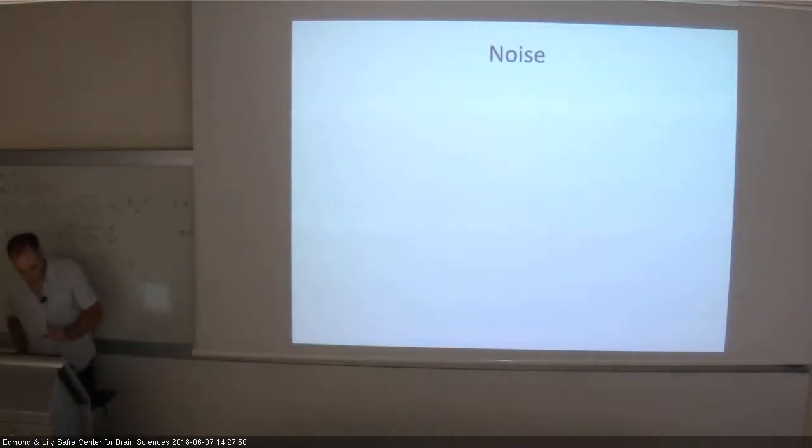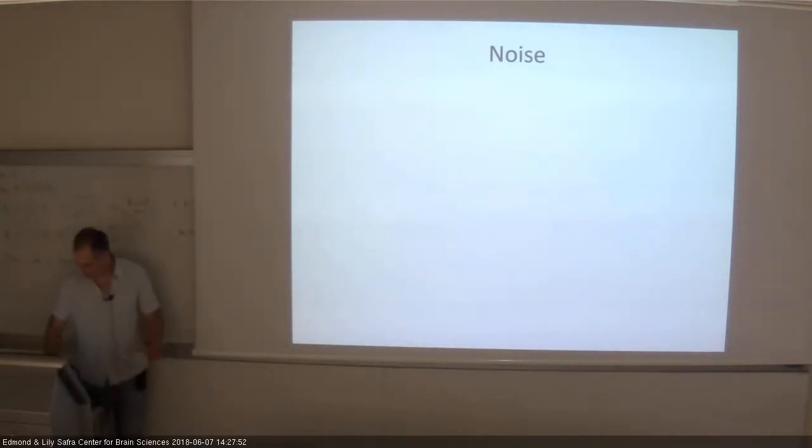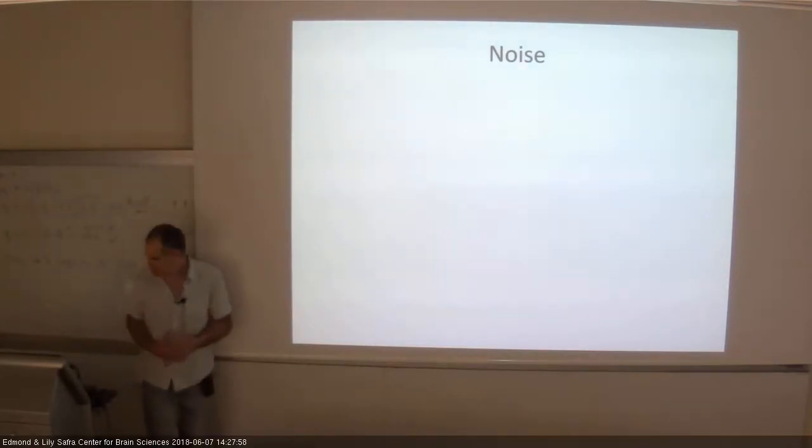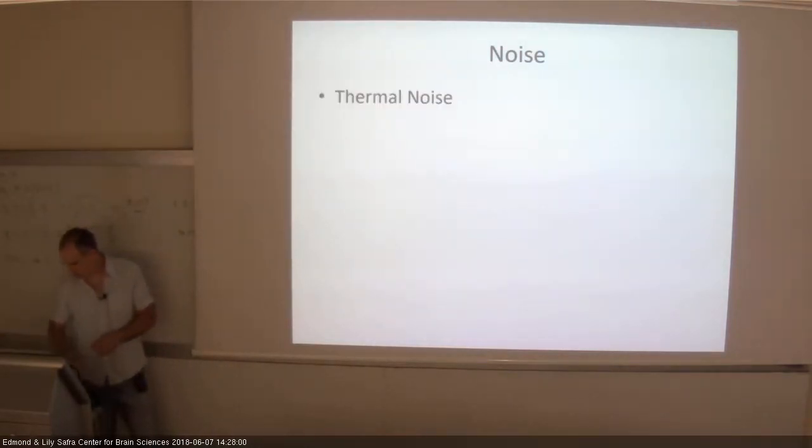So I'm going to spend the next 20, 30 minutes talking about the noise and pre-processing and also the signal. And that's that. So what kind of noise, maybe it was also in the paper, can you tell me what kind of noise we are expected to have in the fMRI environment? If you remember. Well, thermal noise, don't say thermal noise, it's on the board already. Noise of the image when you... Right, yeah, you can have that. Head movements, all right, what else?